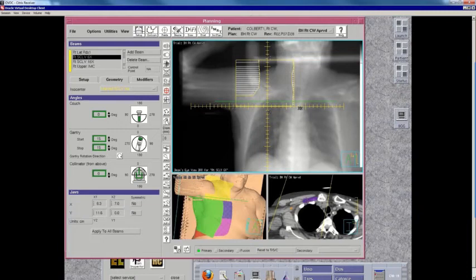So in my mind, for a patient with more locally advanced disease, it makes a heck of a lot of sense to have Rotter's nodes as one of your targets. And to do that, you need to come out like this. I also would say I don't think that this field in and of itself increases morbidity drastically, although patients do tend to have a little bit more fibrosis of the pec muscle, and they need to be nagged to do range of motion stretching exercises to make sure that doesn't become too bad for them.